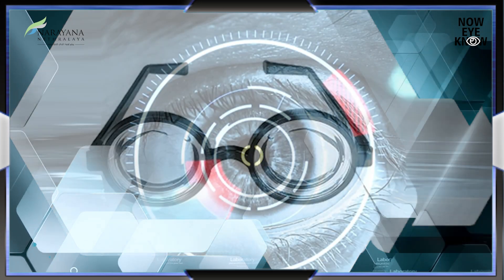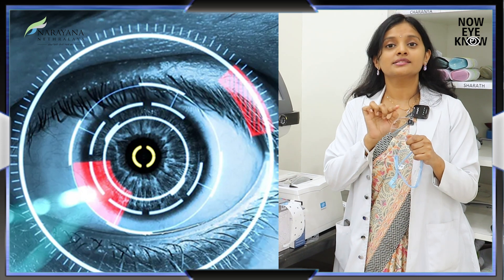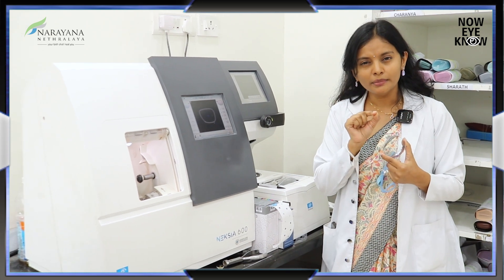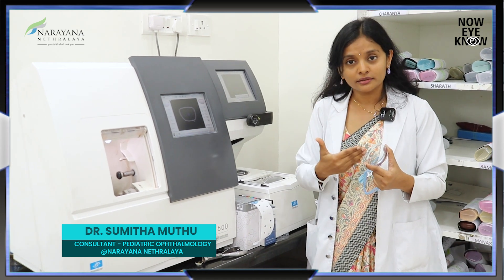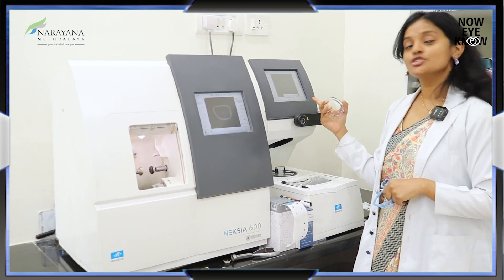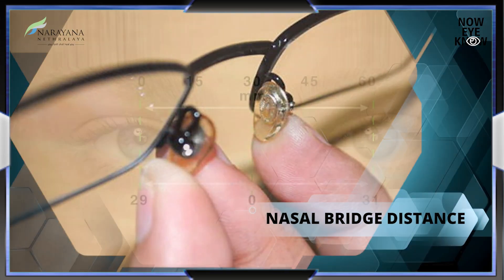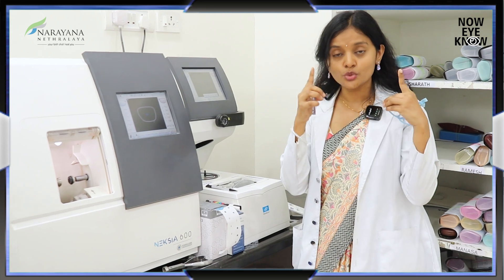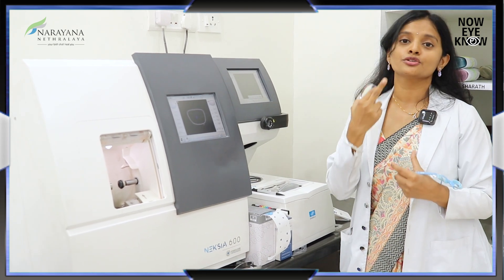Whenever the lens power is very high, it's very important that the center of the lens — this is called the optical center — corresponds to the center of the eye. Even a millimeter change in the centration can actually alter the power, and it can also induce a small amount of squint. This is a tracing machine which accurately calculates the nasal bridge distance. It also calculates the interpupillary distance, or the distance between the two centers of the eyes, and accurately makes the center of the lens correspond to the center of the eye.